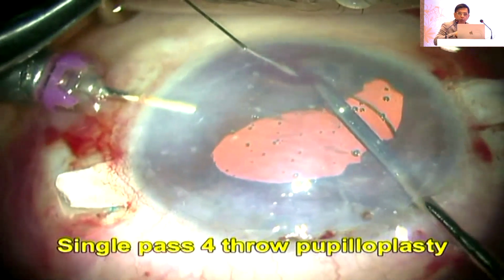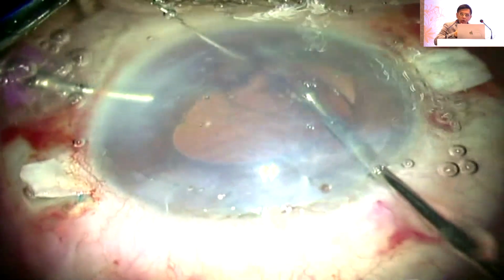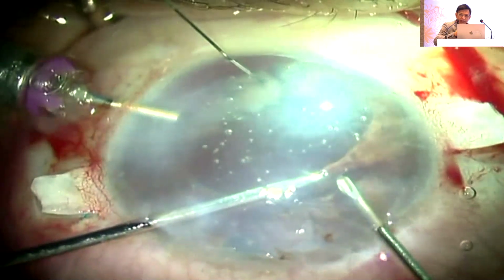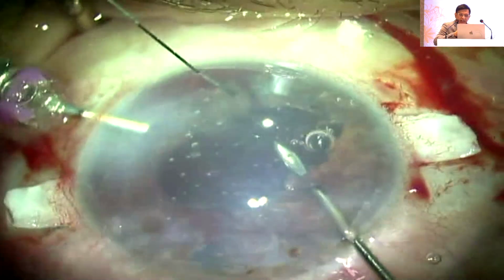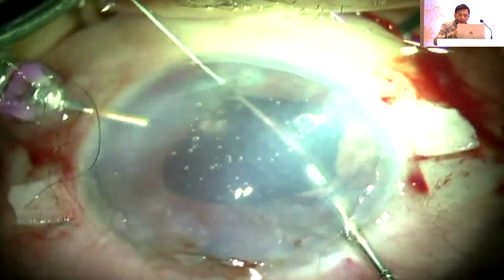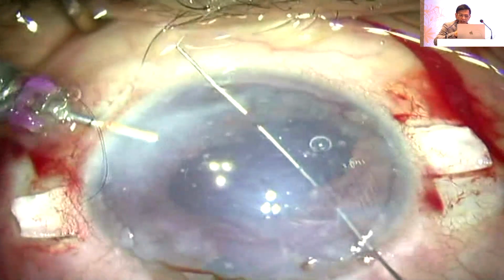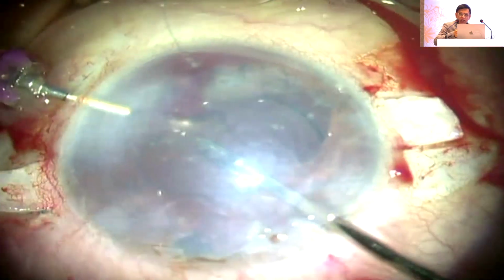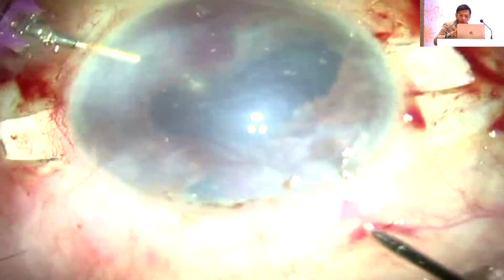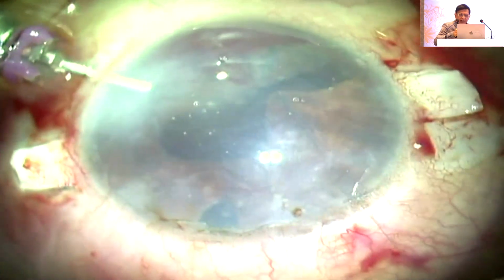Now I do the four-throw pupiloplasty. Now remember one thing, in this I'm also making a closed angle open. I'm also doing a pinhole so that any astigmatism gets neutralized permanently in this patient, because whatever the astigmatism, it does not matter. Whatever the HOA, it does not matter if you made a pinhole. Now you can see I'm doing the pupiloplasty, and the advantage in this is you can do it as many times as you want. And it's a very simple technique. If someone has not done it, please, you can start on this. Remember the number 4, pull on either end, and that completes it.